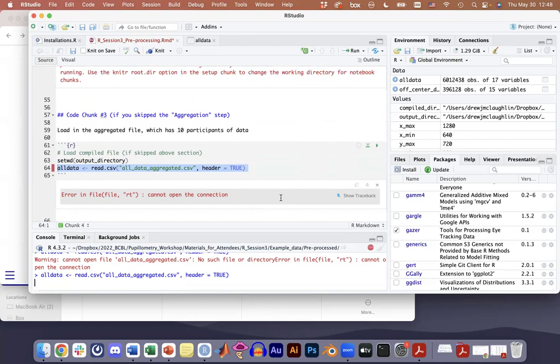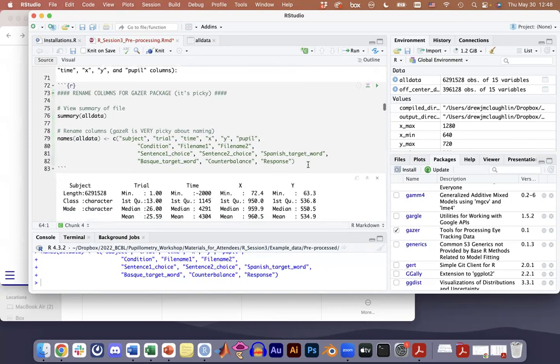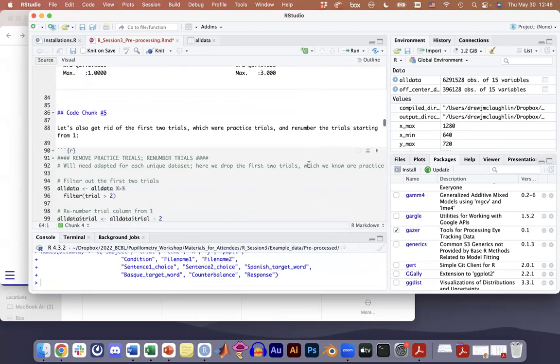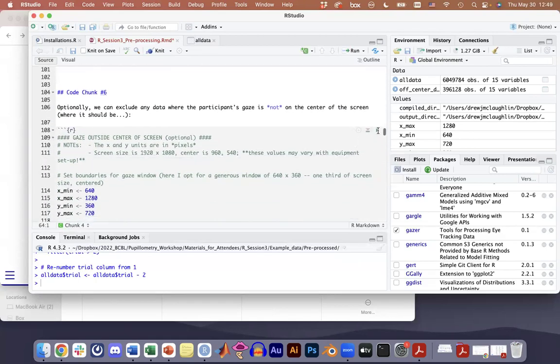Oh, I didn't repeat Kiara's question, but it was about what if you want to apply different thresholds to each of them? And I'll give you my advice, which I will say I haven't done this in any of my papers. I've just stuck with the 20% across the board. Like I said, I'm working with a population where if I have to throw out a participant, it is very easy to replace them. And that's very notable.